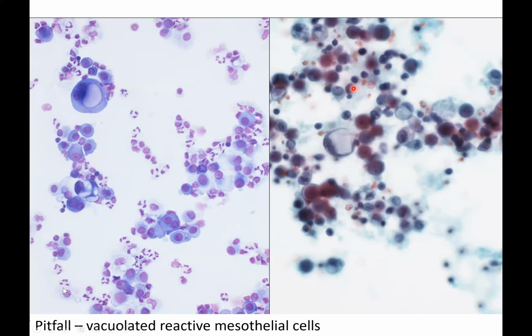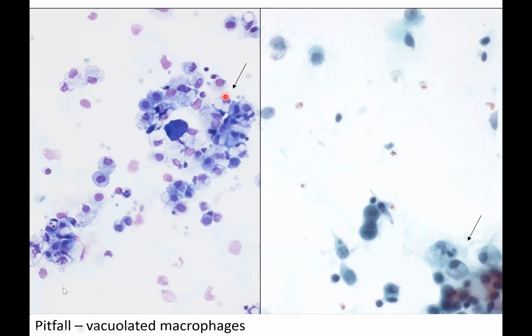Mesothelial cells can acquire vacuoles either as a reactive or degenerative reaction, and these can be confused with signet ring carcinoma. It's important, therefore, to pay attention to the nuclei. Here we can see there are small nuclei in binucleate mesothelial cells. Vacuolated macrophages can also pose a problem in reactive effusions. Quite often there's more than one vacuole and frequently 2, resembling 2 little butt cheeks there.